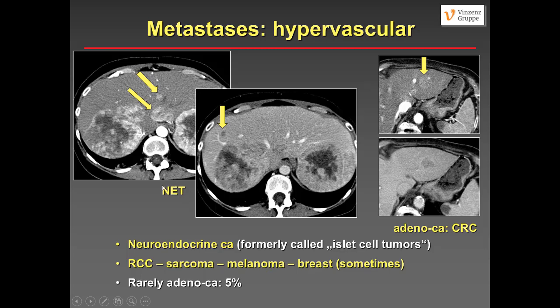This is a patient with a malignant neuroendocrine tumor — a glucagonoma. You see these metastases better in the arterial phase than in the venous phase. But beware: there is one metastasis which was only seen in the venous phase, so arterial phase imaging alone is clearly not enough. Also, adenocarcinoma metastases can be hypervascular — this case shows a large metastasis in the left lobe which is hypervascular with washout in the venous phase, from a sigmoid colon adenocarcinoma.